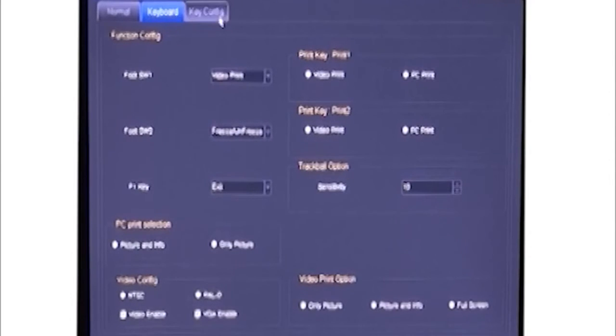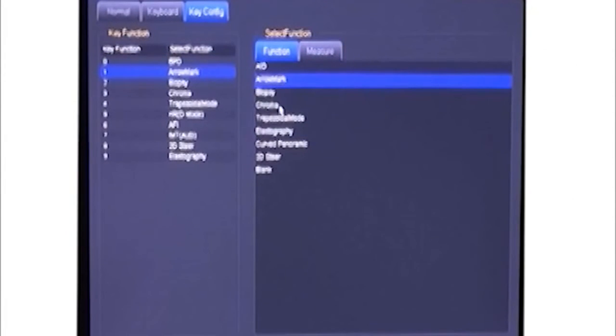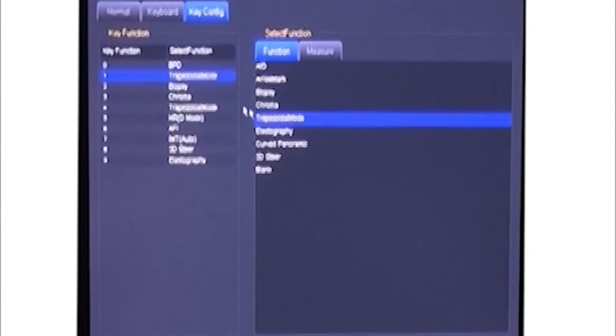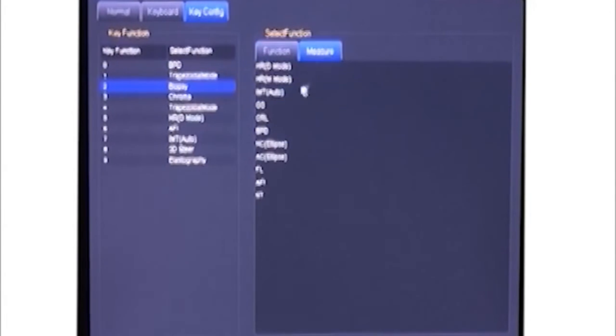Here, the key configuration. We call it the hotkey function. You can redefine different functions or OB measurements from number 0 to number 9, which saves doctors a lot of time.